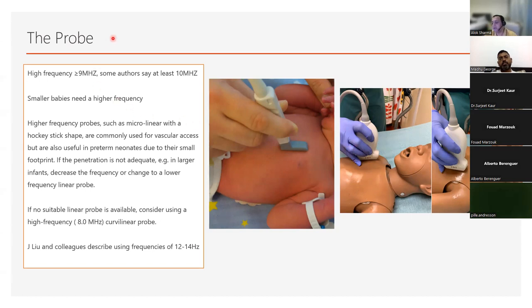Now you can have these presets, and the way to do that is if you don't already have a good relationship with the people who run and help you with your machine, which is technically the company personnel, then you need to build that relationship because you'll need presets for everything. And having a preset makes life much, much easier for you. Not only that, you can alter a preset and optimize your image simply by clicking on it. So it's really helpful to have a preset.